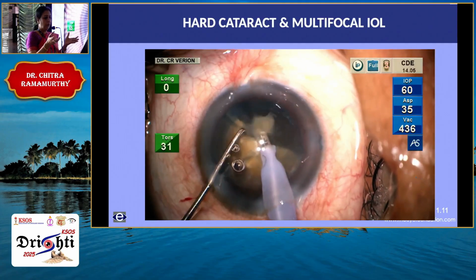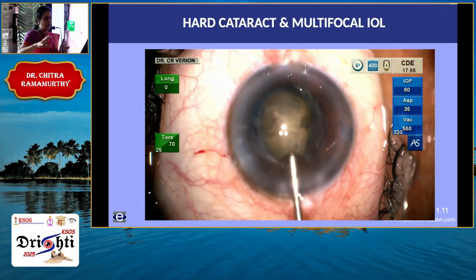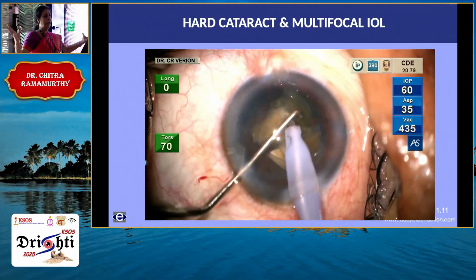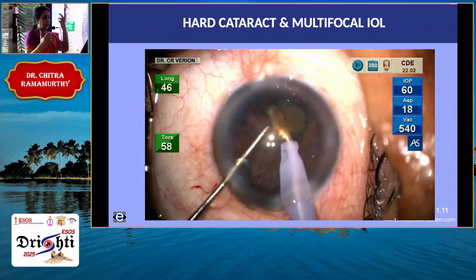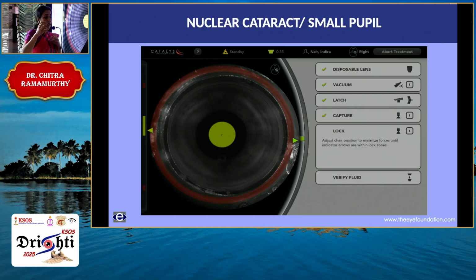Here, however, most of the pieces were created, but as you go down to the last few fragments, you slowly bring down your parameters, because the posterior capsule could be a little lax without the contents, so it could get trampolining into the phaco probe. You don't want that.